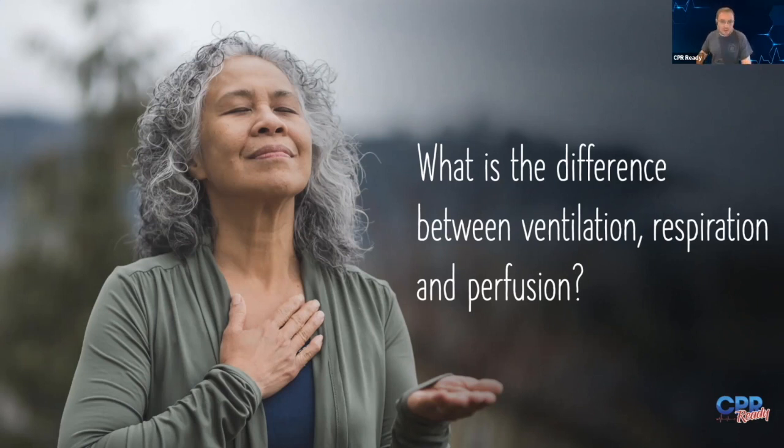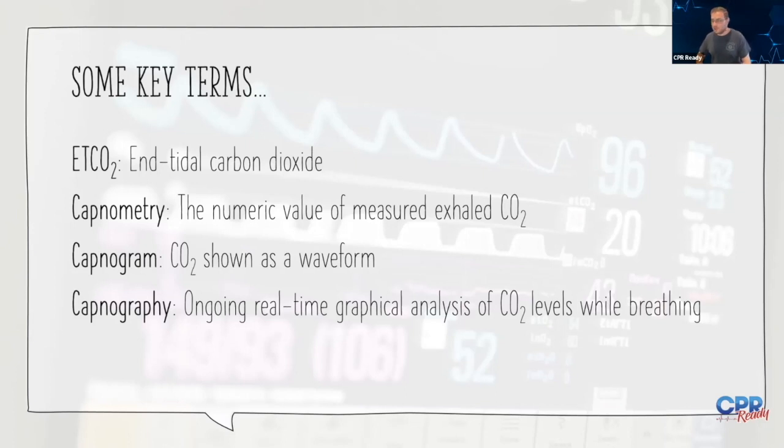Excellent, perfect. So let's talk about a few key terms that I want to make sure we're all on the same page about. We talk about EtCO2, which is our end-tidal carbon dioxide. That's the actual concentration of the CO2 that gets measured when a person exhales. Capnometry is the numeric value of the measured exhaled CO2. The capnogram is what we call each one of those waveforms that we're going to be looking at in a moment. And then at the end, we have capnography, which is putting it all together and giving us that real-time continuous waveform analysis of the CO2 levels.